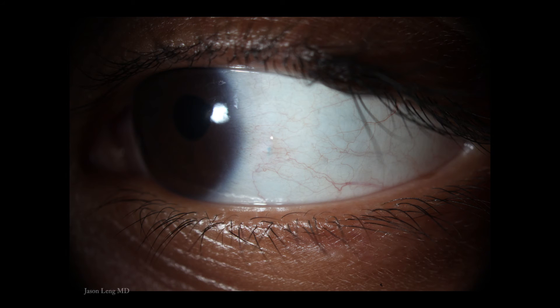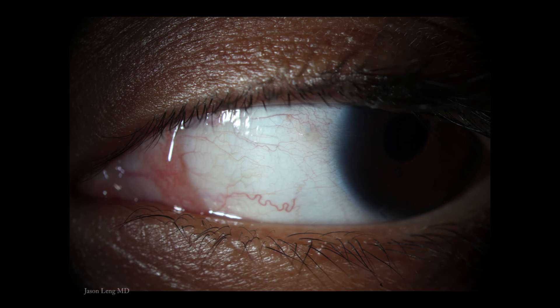Here are photos from the post-op week one exam, and now the patient has a best-corrected visual acuity of 20/20.